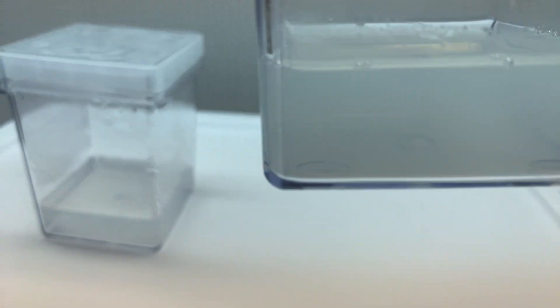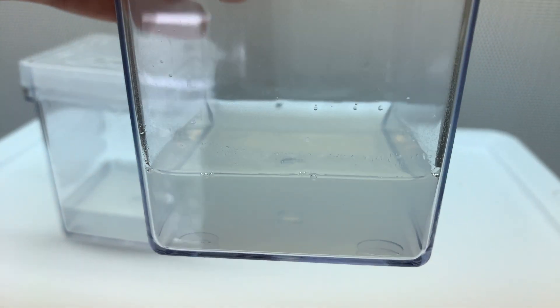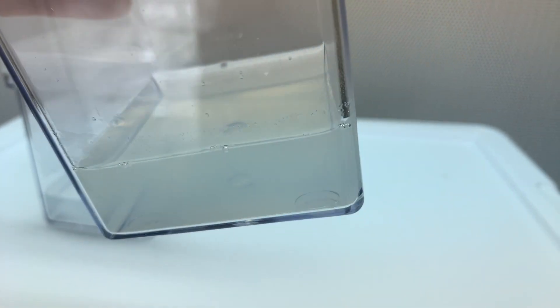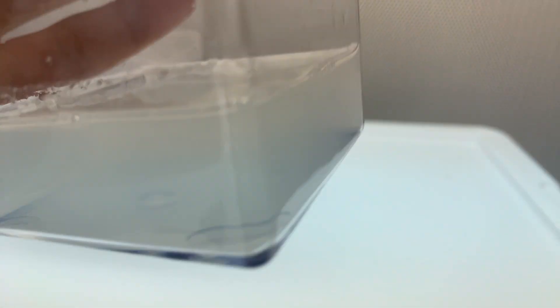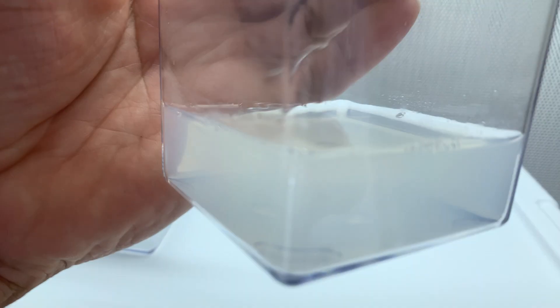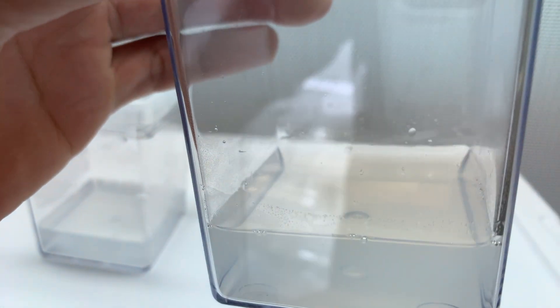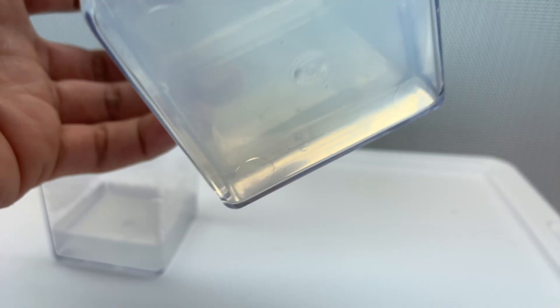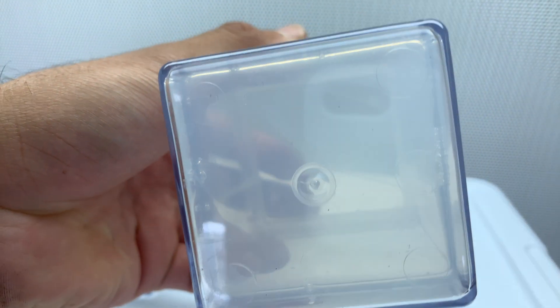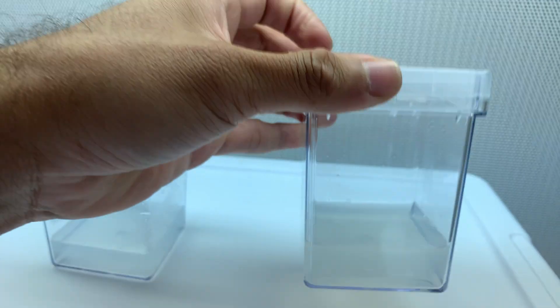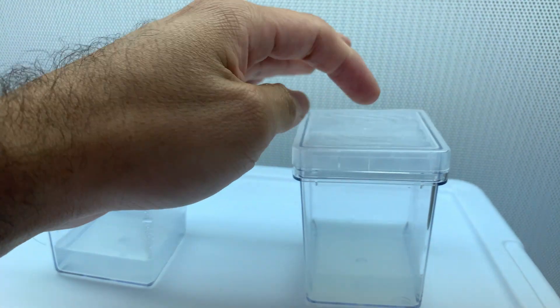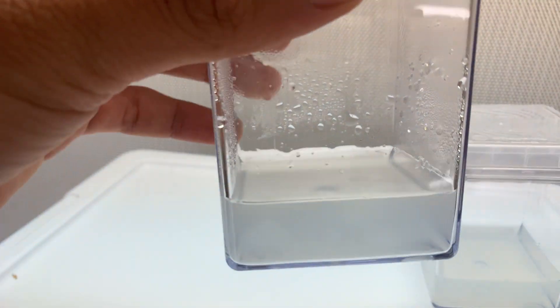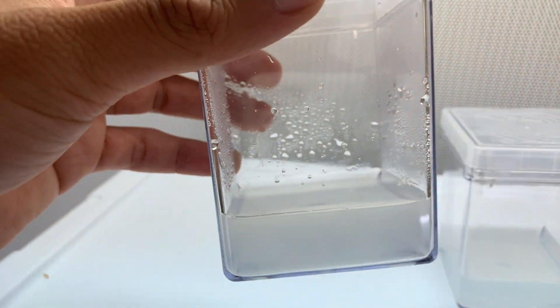This one doesn't have any bacteria whatsoever, or as far as I can see. It doesn't have any contamination, looks very clean. This is the one with Agar.